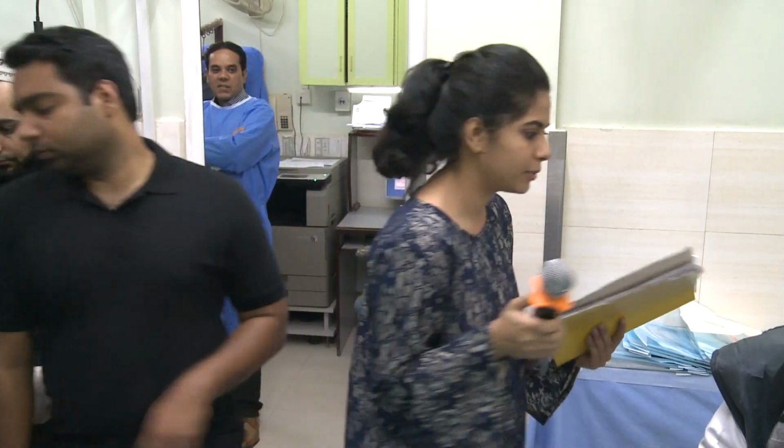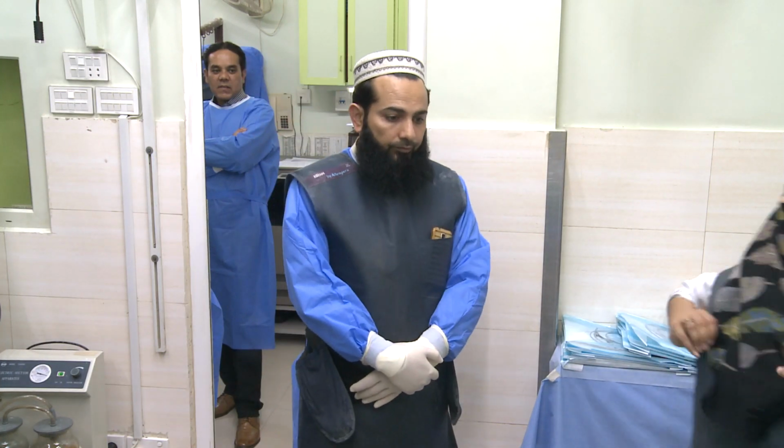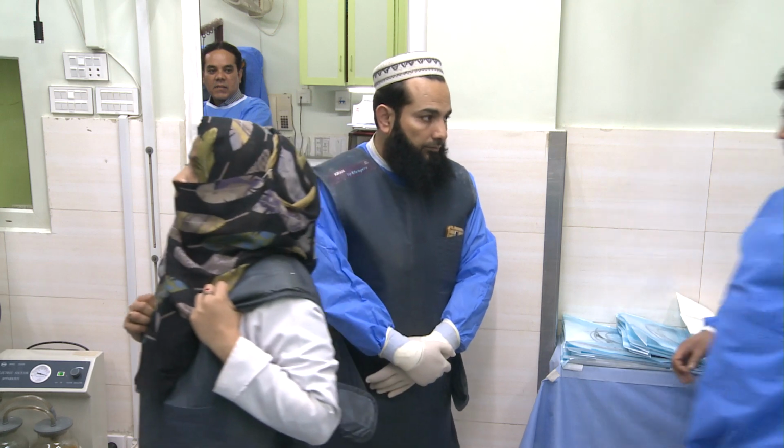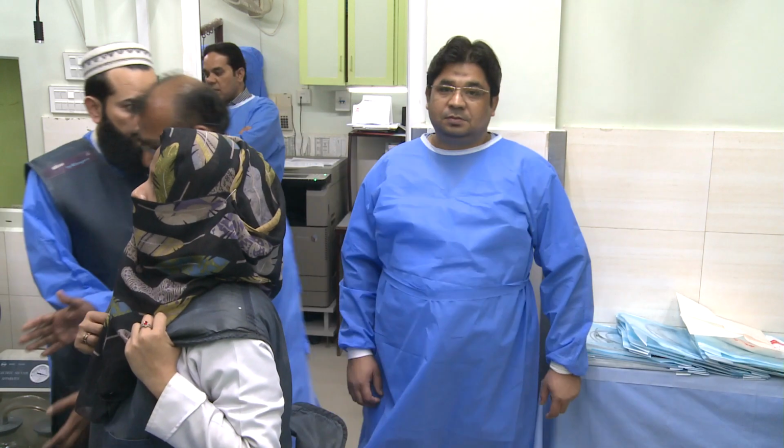So, this is a clearly dilated CBD with abdominal pain and a normal LFT. So, this is SOD. And the dangerous one. See, I have. This is interesting.